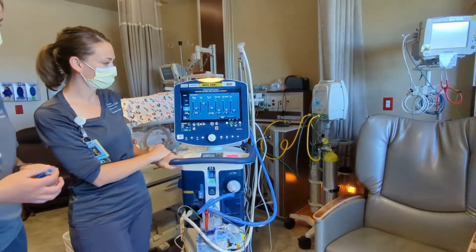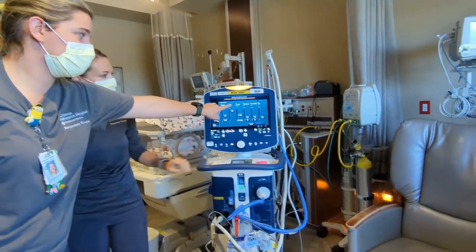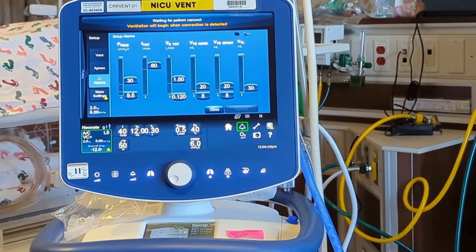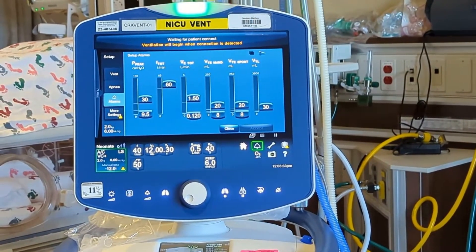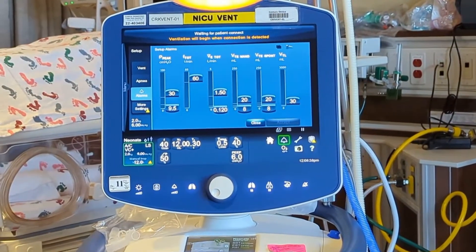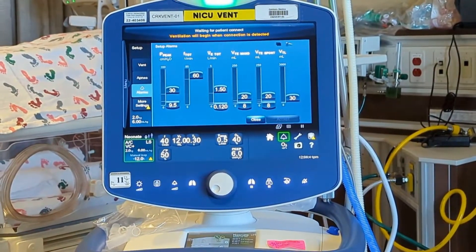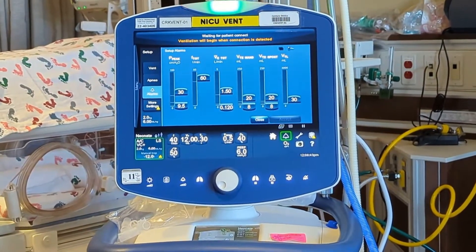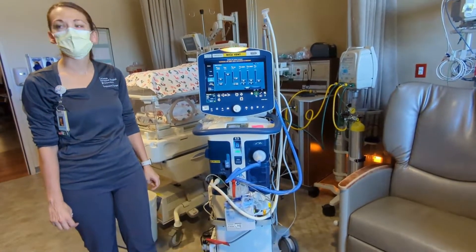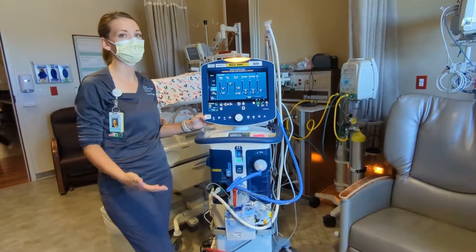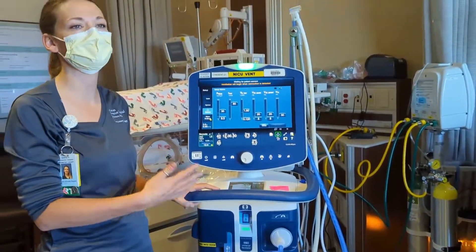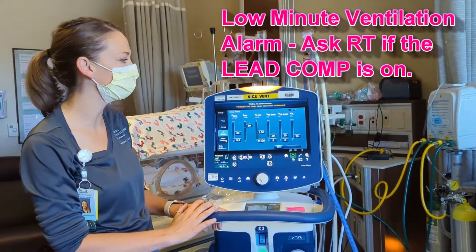Another alarm you're going to see a lot is low minute ventilation — because we have an uncuffed ET tube, air is going to escape around that tube. I generally do not like to turn off any alarms, so it may occur as a nuisance alarm. You always want to troubleshoot by assessing your baby and the ventilator. We do have a tool called leak compensation we can put on — so just ask, is leak compensation on? That's something to consider.